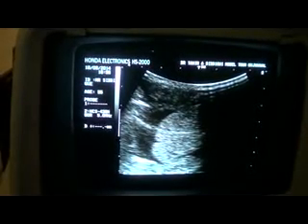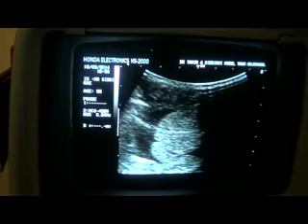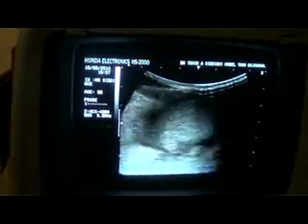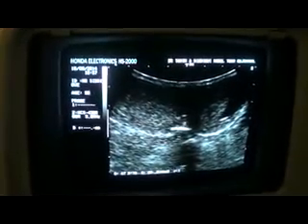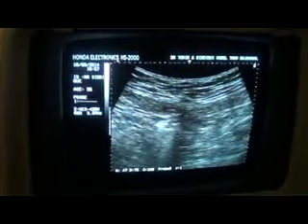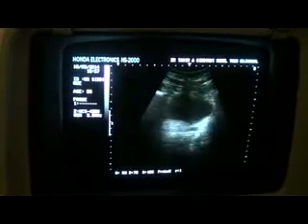Reviewing the findings: there is bilateral hydrocele. There is a small-sized, irregularly outlined left testis with multiple tiny echogenic particles, and the thick spermatic cord is seen. Coming toward the abdominal KUB scan as part of the examination.